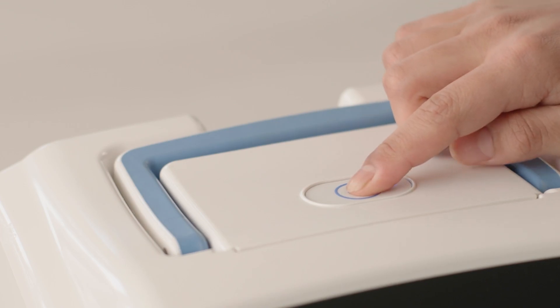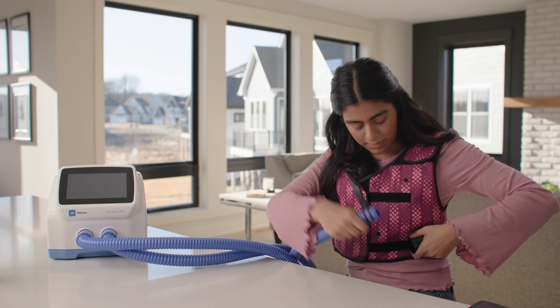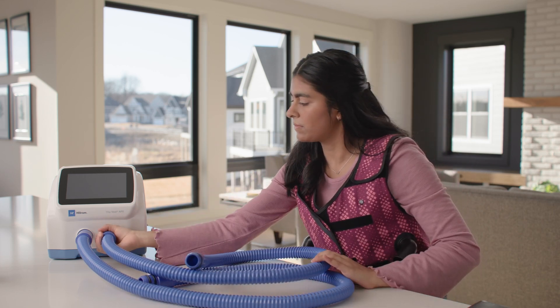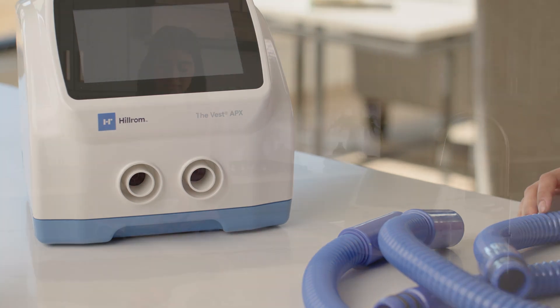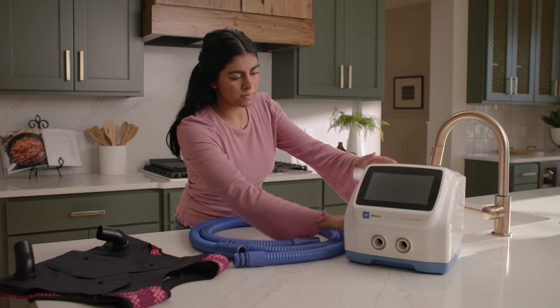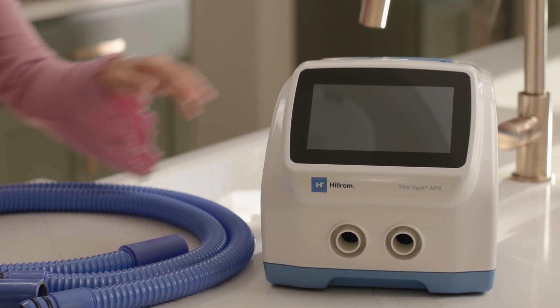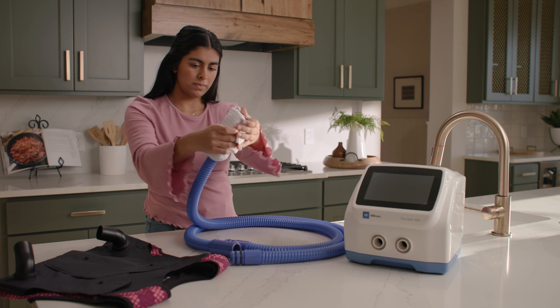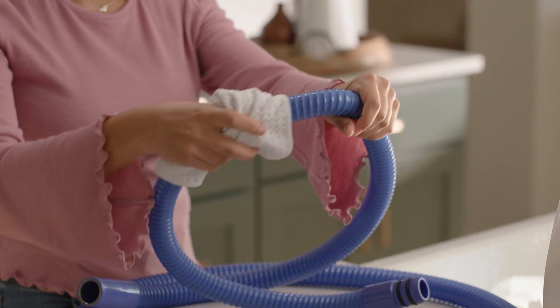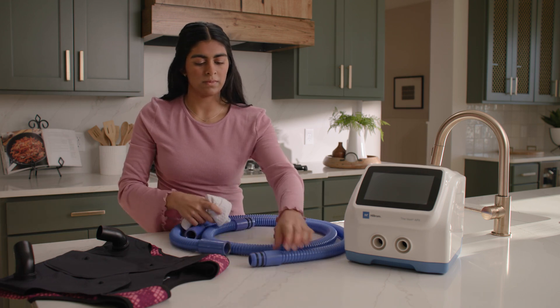To prepare for cleaning, turn off the control unit and unplug it from its power source. Disconnect the air hoses from the garment and the control unit. Clean the control unit and air hoses, including the hose ends, using a clean, damp cloth and a mild household soap solution or alcohol. See the Vest APX system instructions for use for a list of compatible cleaning solutions. Make sure there isn't excessive moisture on the cloth before using it to clean the control unit. Do not steam or spray clean the unit or air hoses, as pressure and excessive moisture could damage it and its electrical components. Inspect the control unit and the air hoses to make sure there is no visible soil remaining. If necessary, repeat these steps.